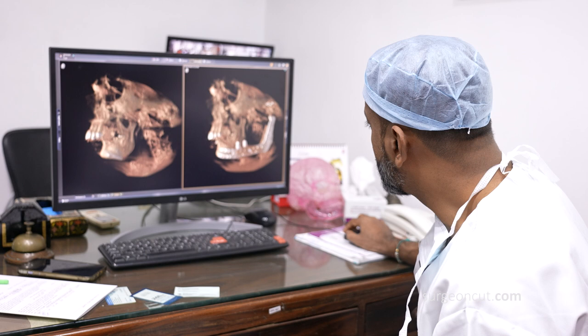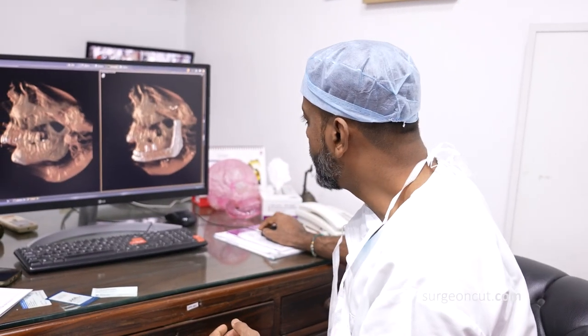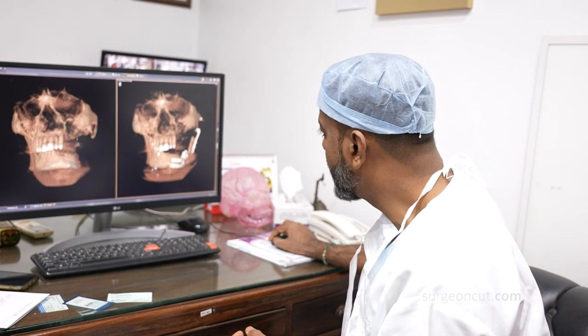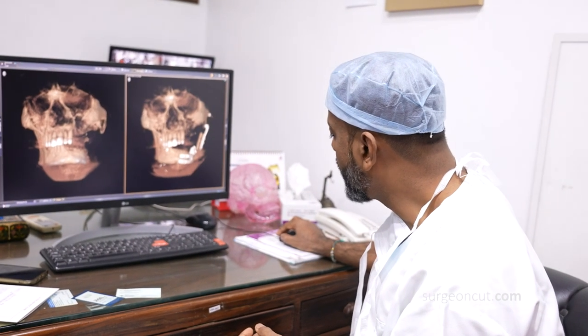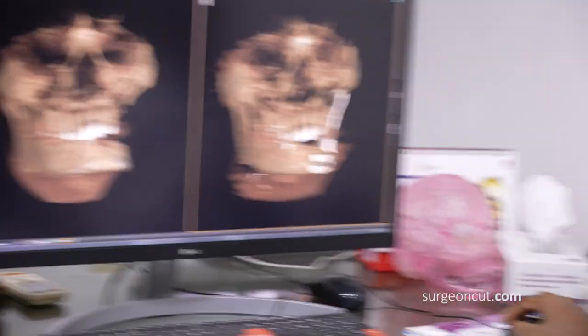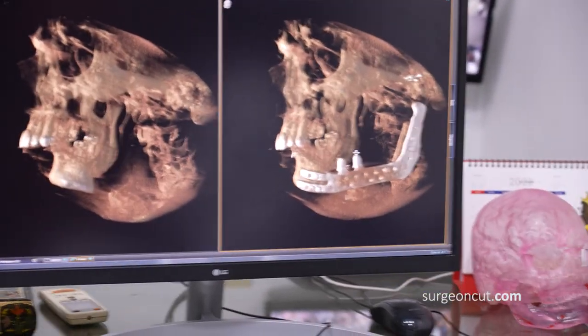These two stumps that you see are our patient-specific implant abutments. So the teeth would come on these later on. So everything is healed and nice. And you see two small clips here. We call them eyelets. We would take them off eventually once all the healing is over.